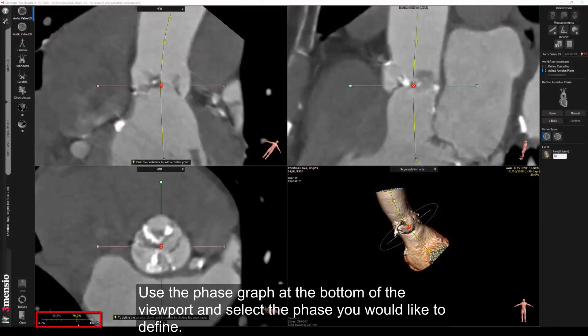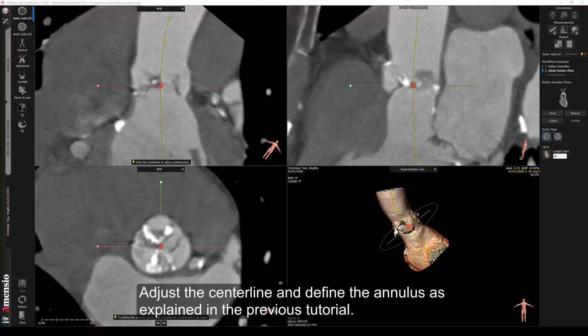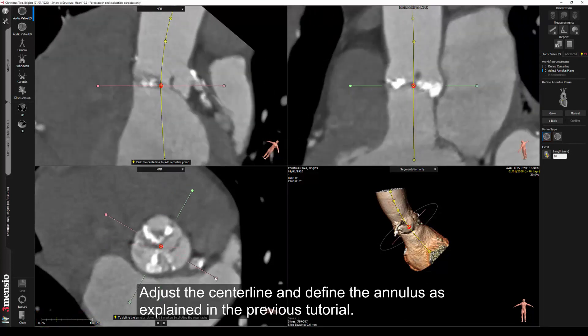Use the phase graph at the bottom of the viewport and select the phase you would like to define. Adjust the centerline and define the annulus as explained in the previous tutorial.